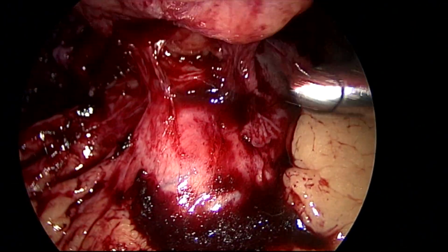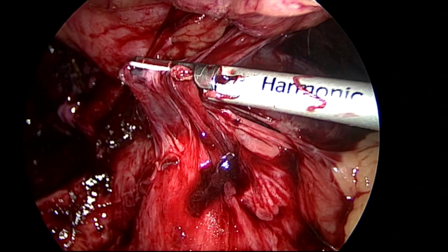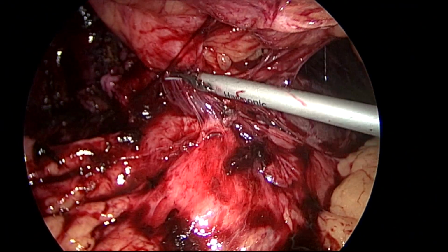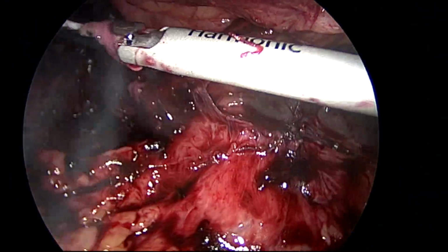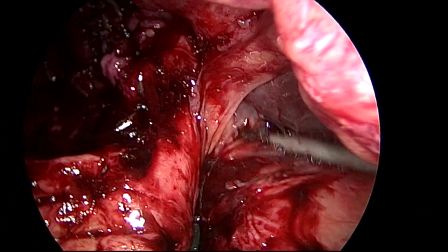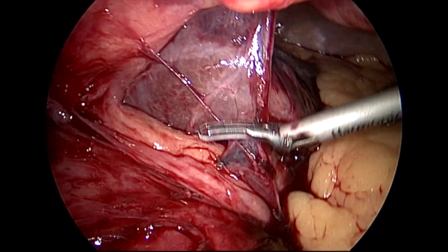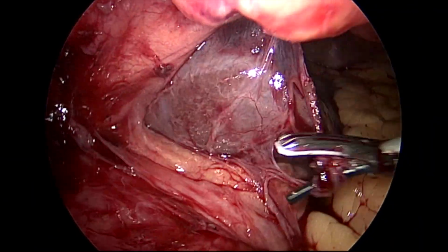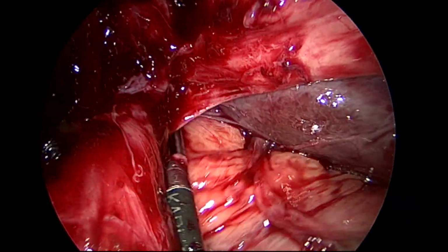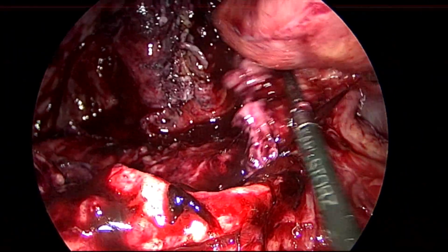So, what I did, I started mobilizing the structures from the falciform ligament. So, this is the antrum, the antropyloric region. I am separating it from the falciform ligament. You can see all the tissue is now very much inflamed, with a lot of plaques, adherent. So, it is a very difficult case. Now I am reaching the middle of the falciform, the midline.